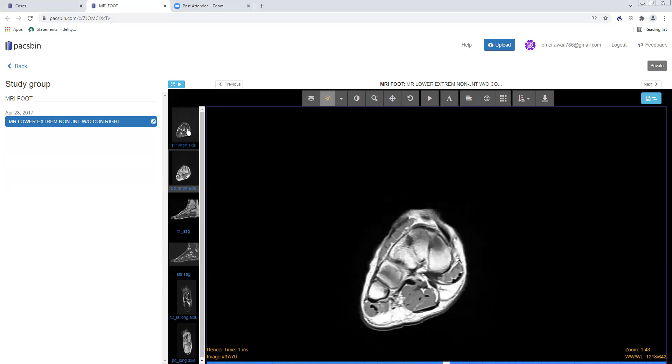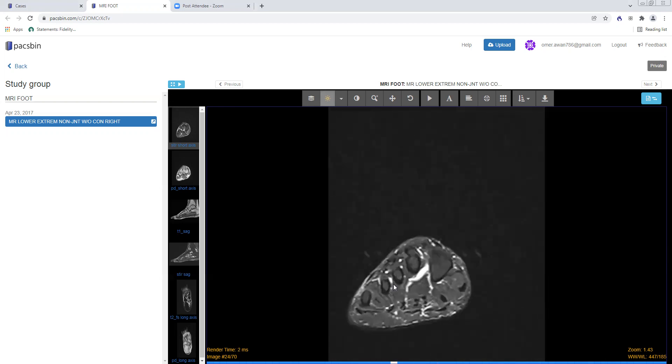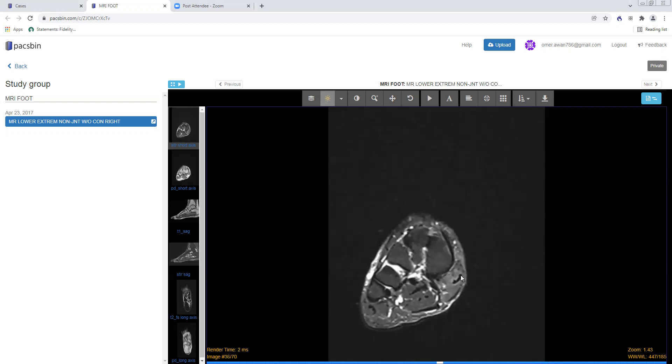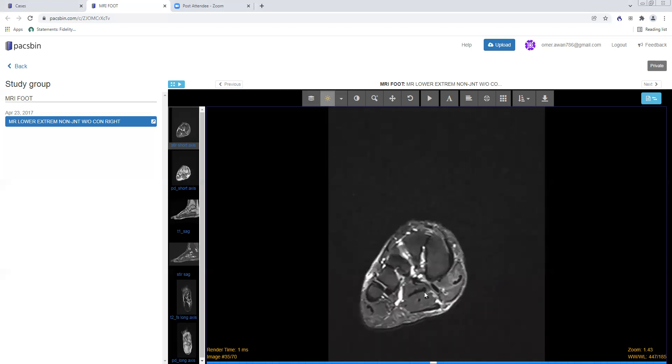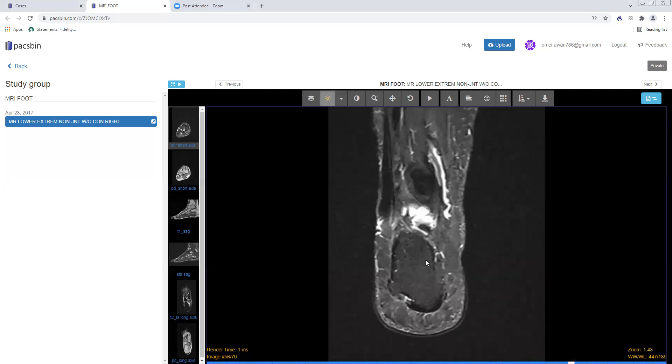On the coronal short axis STIR images, I want to look at the muscles and make sure they're all normal with a normal gray signal intensity. There may be some minimal T2 hyperintensity along the abductor hallucis, but otherwise it looks okay. The abductor hallucis, flexor digitorum brevis, and abductor digiti minimi can be involved in Baxter's neuropathy — neuropathy of the Baxter nerve, which is a branch of the inferior calcaneal nerve coming off the lateral plantar nerve. The quadratus plantae and all the intrinsic musculature — the lumbricals and interossei — should be nice and gray on T2 weighted images.